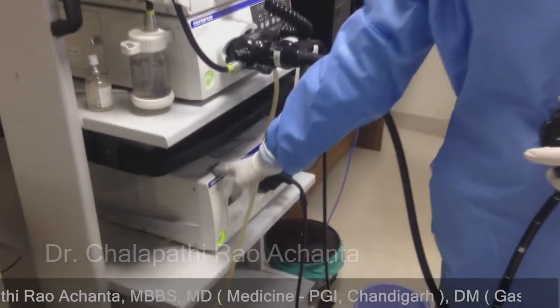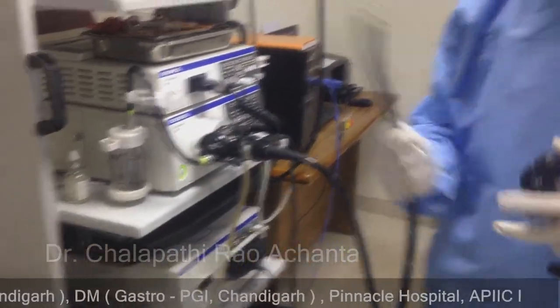This is ultrasound equipment. We have to sync with endoscopic ultrasound equipment.